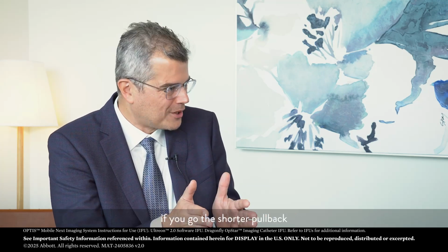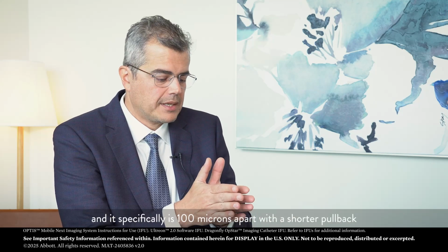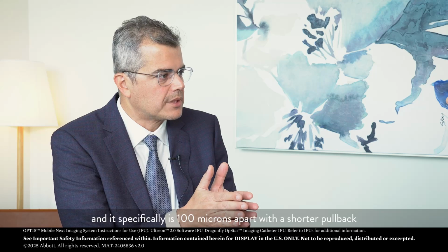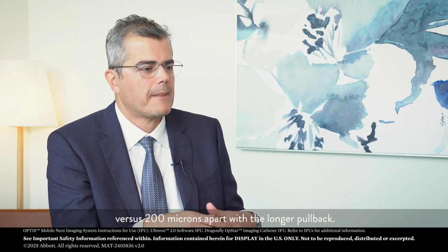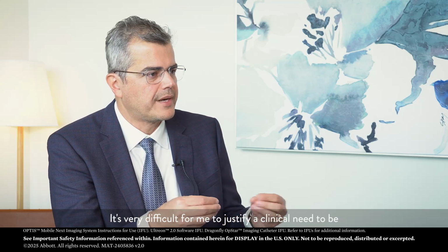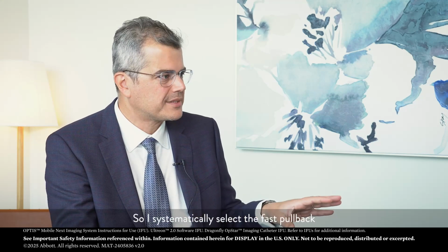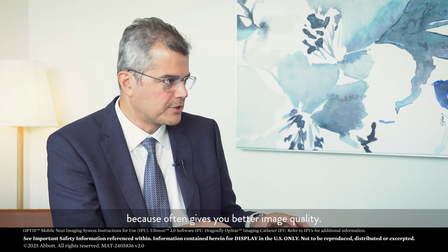So you have a more dense number of frames if you go with a shorter pullback, and specifically it is 100 microns apart with a shorter pullback versus 200 microns apart with the longer pullback. It's very difficult for me to justify a clinical need to be 100 versus 200 microns, right? So I systematically select the fast pullback because it often gives you better image quality.